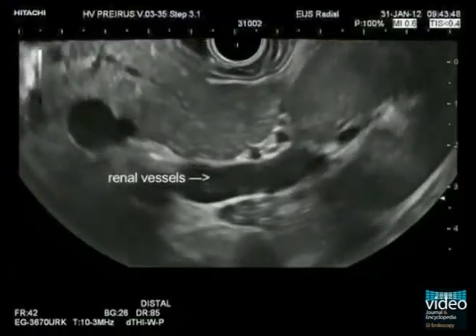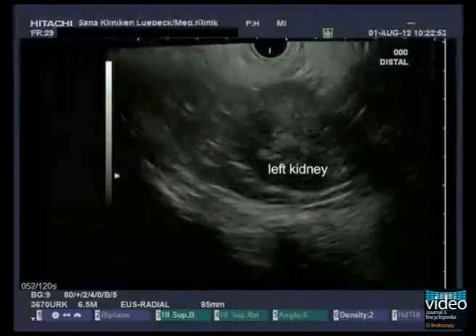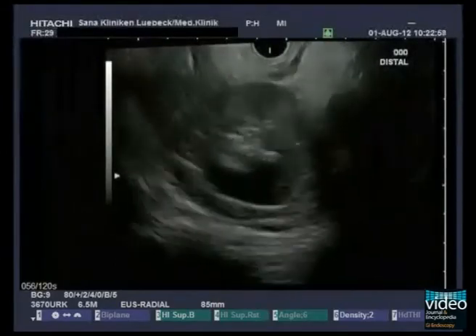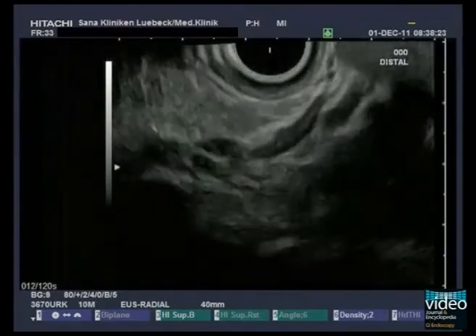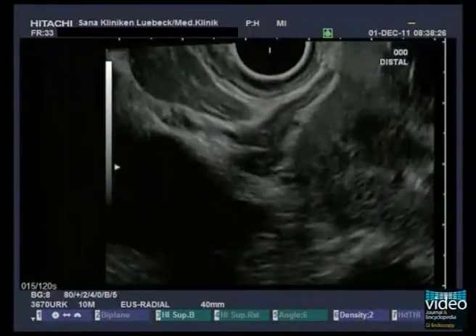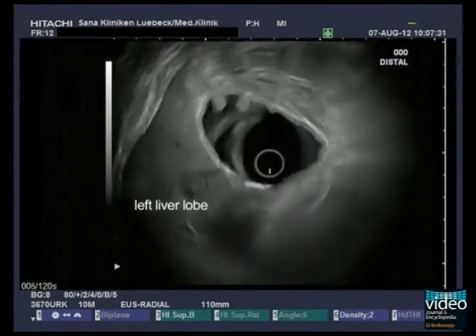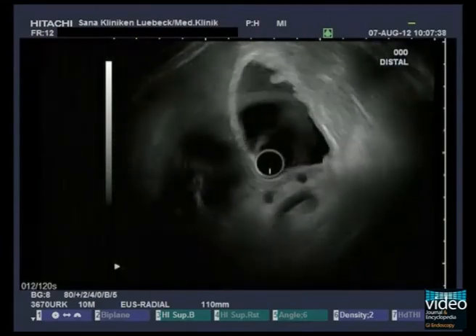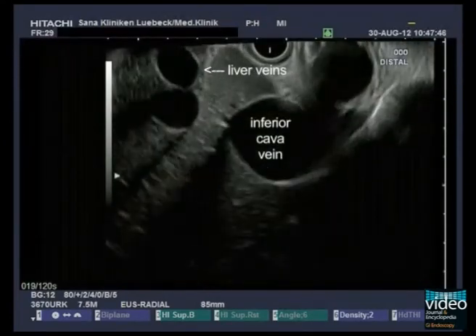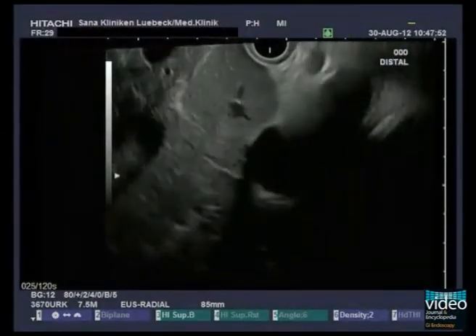On the turn back to the aorta, it is possible to see the origin of the left renal artery together with the vein as well. They can be followed into the renal hilum. In between the cranial pole of the kidney and the aorta, the left adrenal gland appears. In the ventral position of the anterior gastric wall, the left liver lobe with segments 2 and 3 can be seen. By withdrawal of the endoscope, the intrahepatic veins can be followed into the inferior cava vein close to the diaphragm.